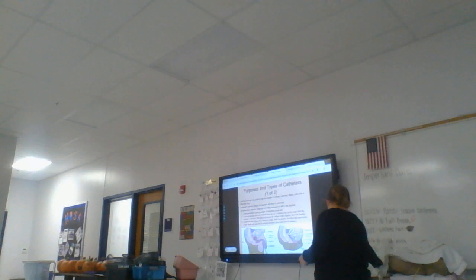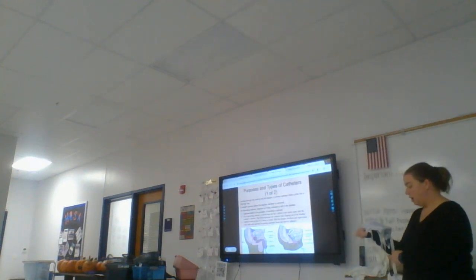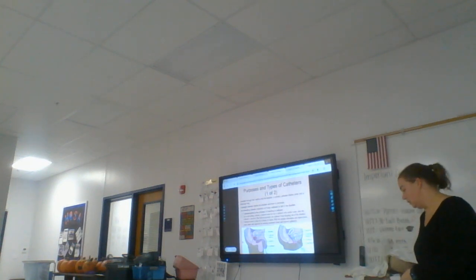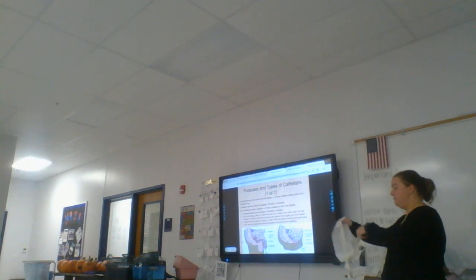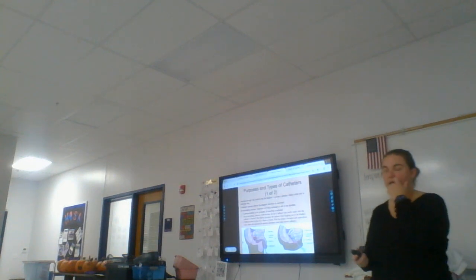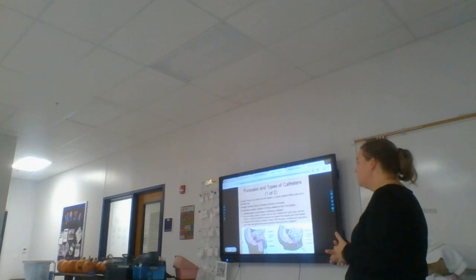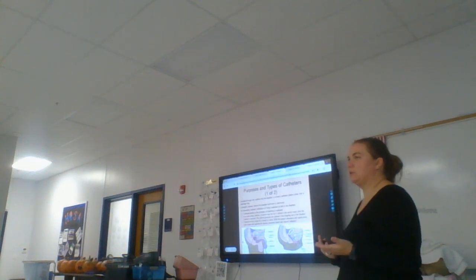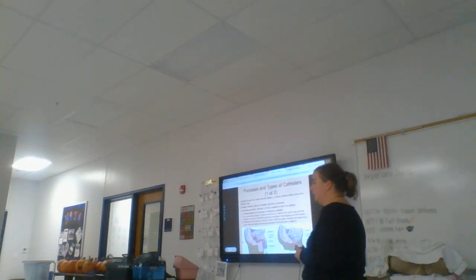There are a couple different types of drainage bags. There's the drainage bag that I have right there. There's also what's called a leg bag, and this attaches either to the thigh or the calf, and these are for patients that mainly have to go home on a catheter, so that they can somewhat keep it concealed as well. Those two examples right there, those bags, are going to be what's called indwelling catheters, meaning it stays there for as long as it needs to, stays inside.